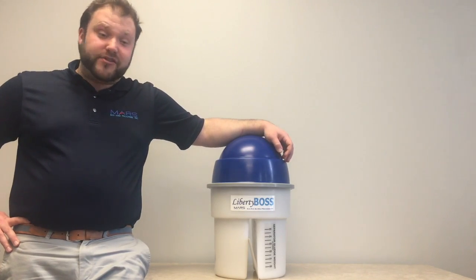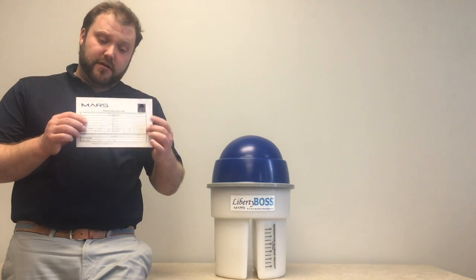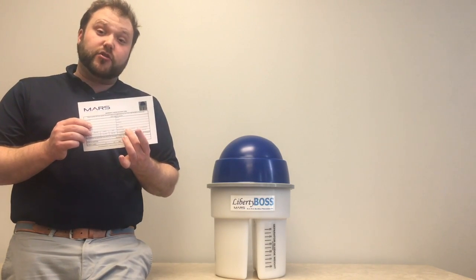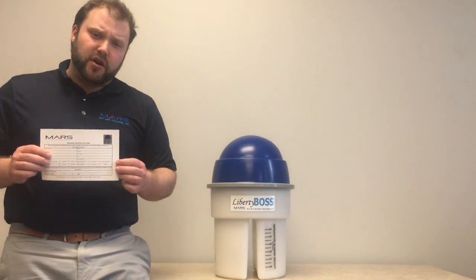Once your technician has installed the system, every new Liberty Boss comes with a warranty card. Please fill out your office information completely and send this off to Mars. What the registration card does is two things.